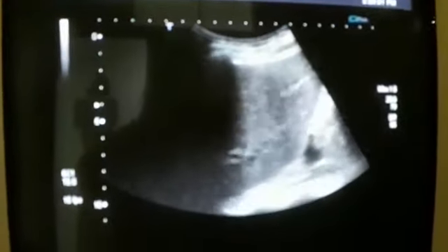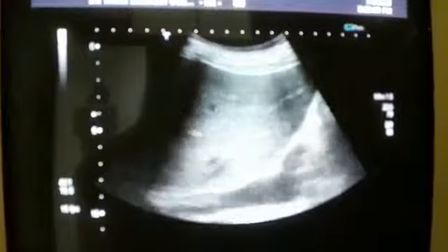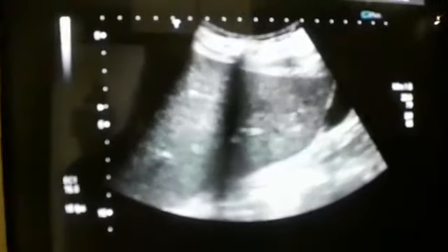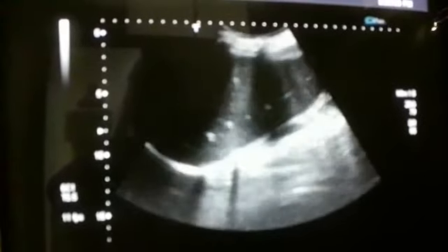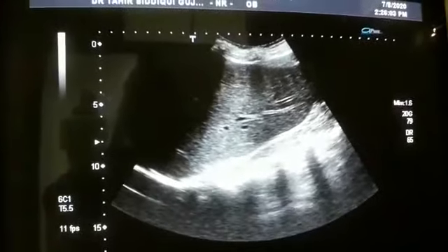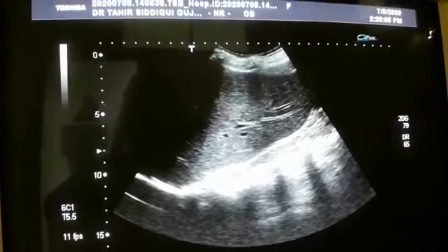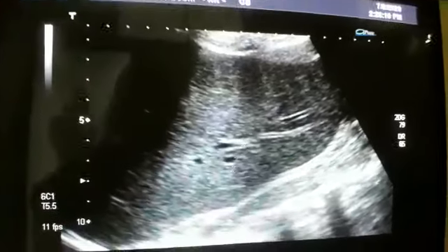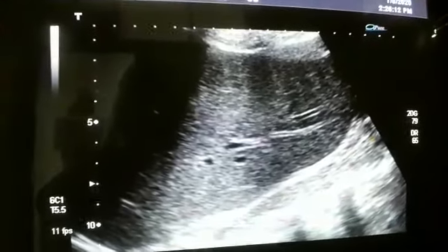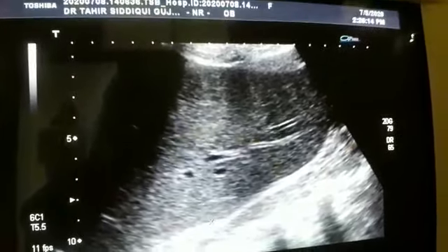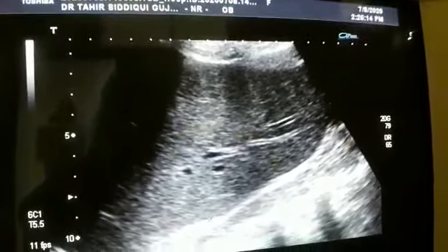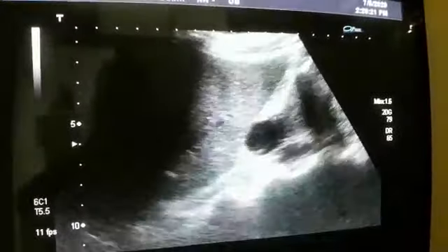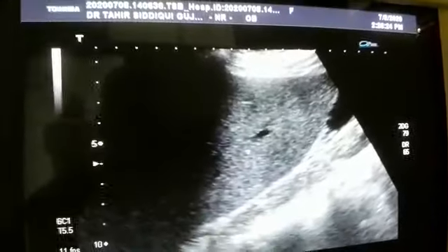Now this is the right side, and again here, liver with absent right kidney — you see the psoas muscle, this is the liver here. The kidney should have been seen here, but the kidney is not here in this normal lumbar region location. So where is the kidney?